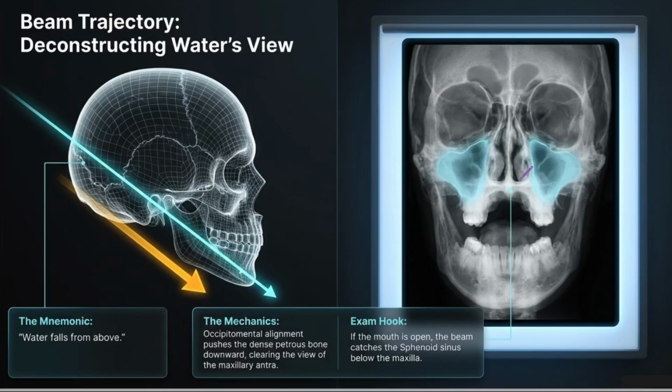And if a patient requires functional endoscopic sinus surgery, or FESS. And that's when a surgeon inserts a tiny camera and instruments into the nose to remove polyps or clear blockages, right? Yes, exactly. If a patient needs FESS, an X-ray simply cannot serve as an adequate map. I mean, you can't navigate a complex 3D cave system relying solely on a flat 2D shadow of that cave. It's impossible. Which necessitates a completely different mapping technology. A surgeon absolutely must read a CT scan before performing FESS.